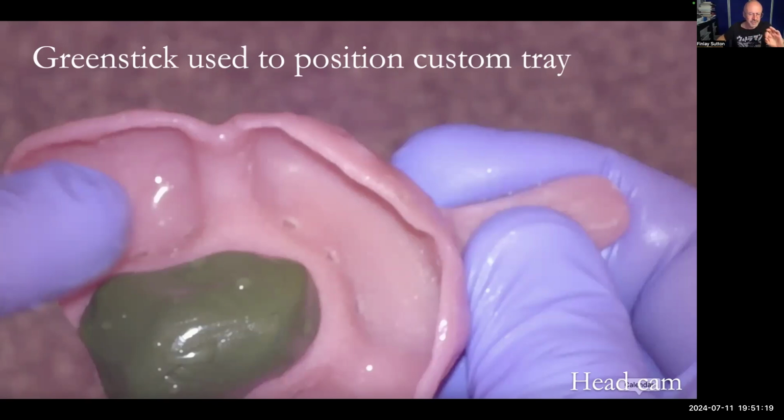Medium-bodied silicone is a terrific impression material as well, instead of the alginate. And if you get better results and are better with silicone, stick with that. But I do think the border molding in denture work with green stick or pink stick is essential. The other material after that doesn't really matter too much. But thank you for that. Pink stick for border molding, absolutely. That's great.